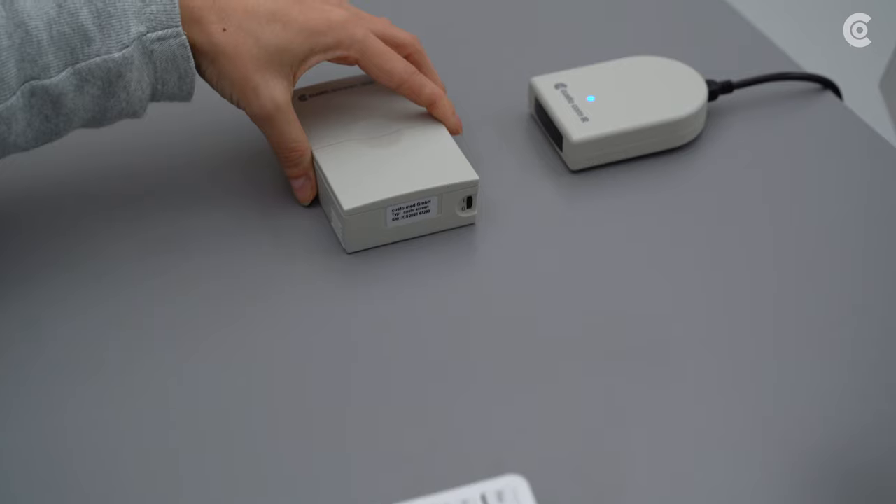In the following video, I will explain to you how to handle the ABPM Recorder CustoScreen 300.